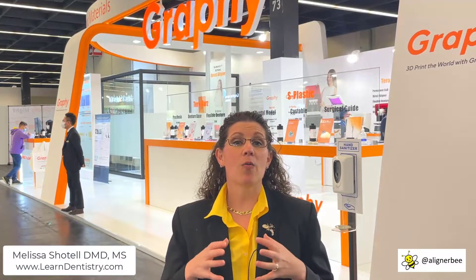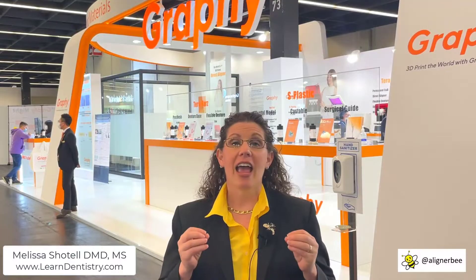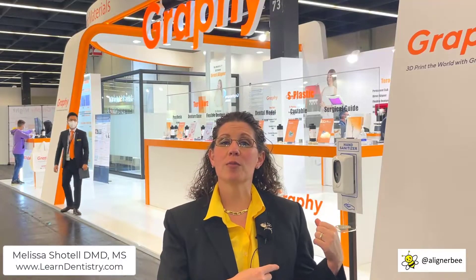The ability to directly print a clear aligner and bypass printing models and creating vacuum forms — this is going to be the next step in clear aligner treatment, reducing our waste and our carbon footprints within our office, and allowing us to really streamline this process. They have a unique printing process, printing vertically on supports, and then a way to clean the aligners, and the material is thermoplastically activated within the mouth.